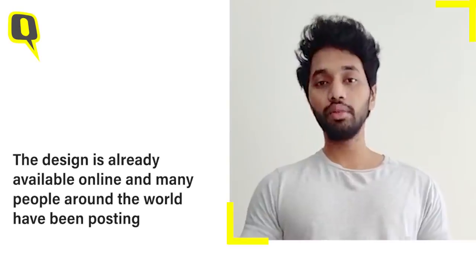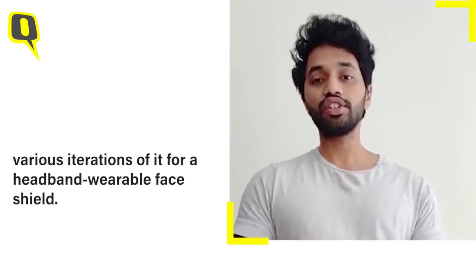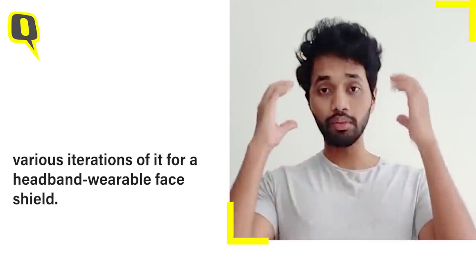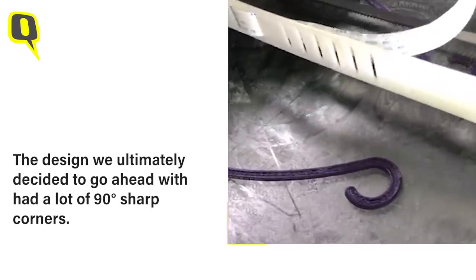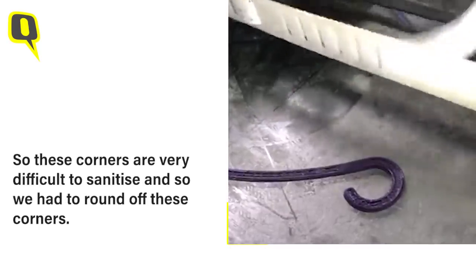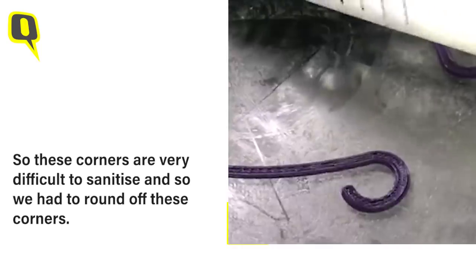The design for our face shield is actually available online. Many people around the world have been putting out various iterations of the design for a headband wearable type of face shield. The design that we ultimately decided to go with had a lot of 90 degree sharp corners. Now these corners are very difficult to sanitize, and so we had to round off those corners.